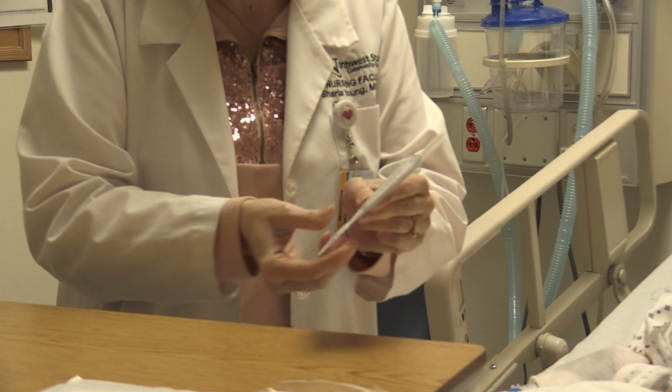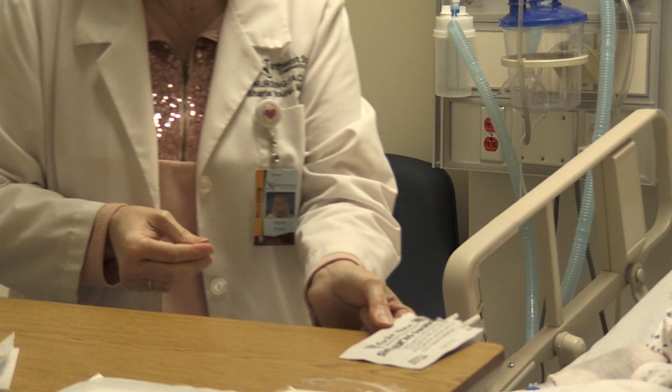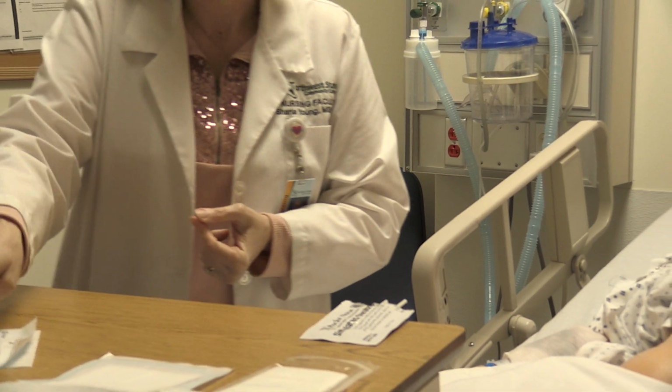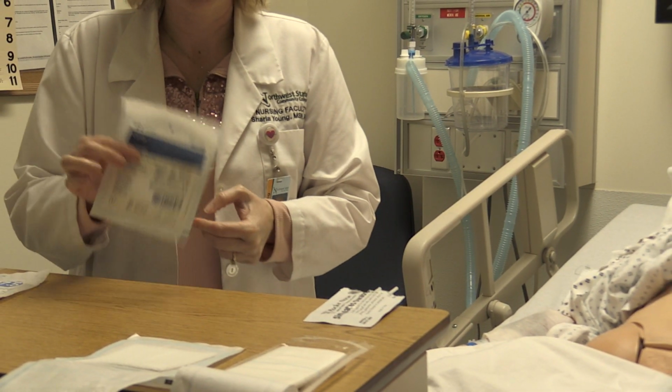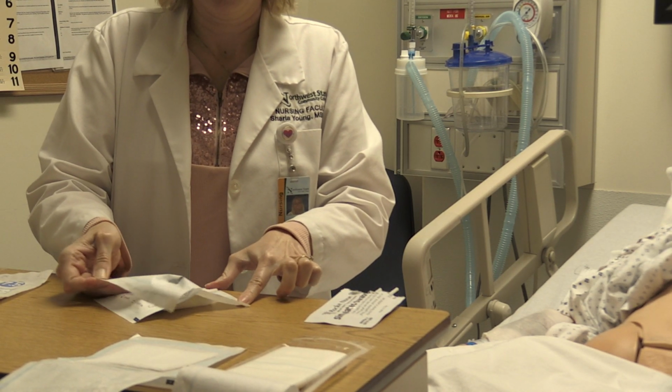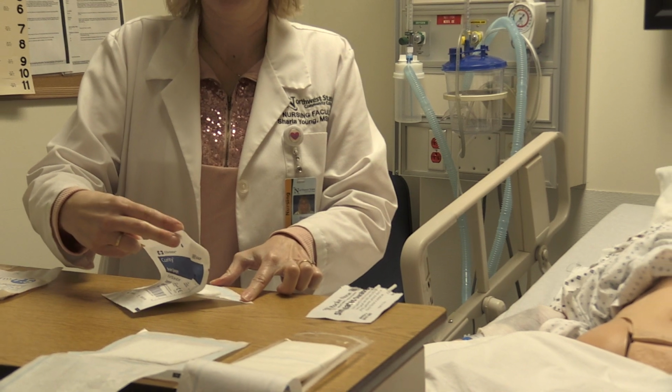Okay, and then I'm going to hang them over the edge of my table. Then, this is the trick part. I'm going to take my drain sponge. I'm going to open this up. Open up my sterile package.